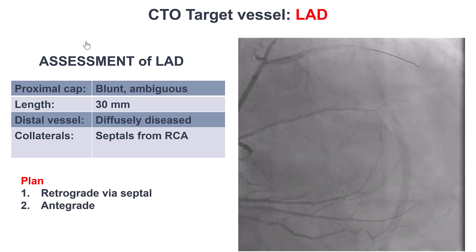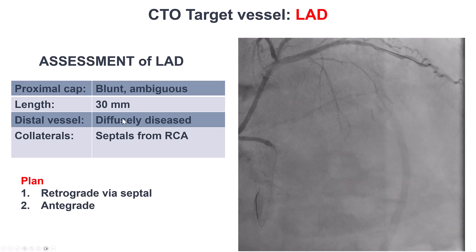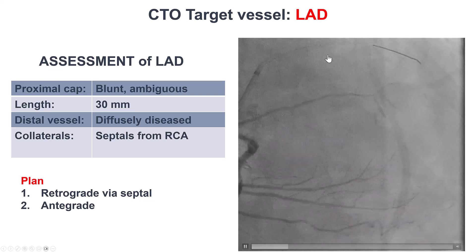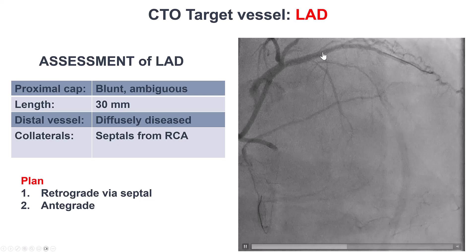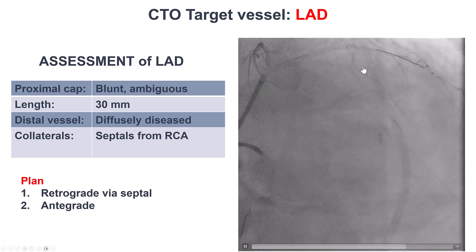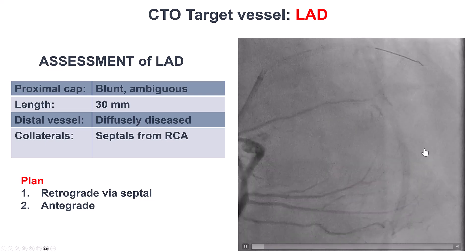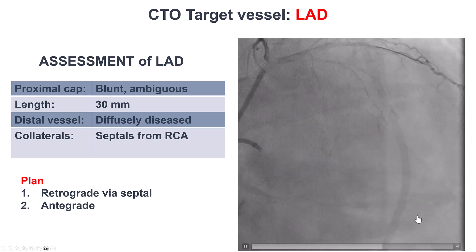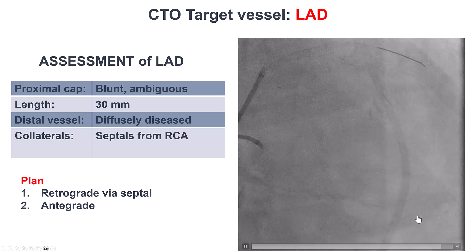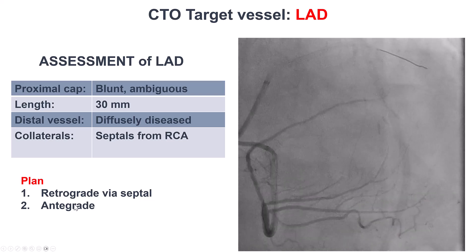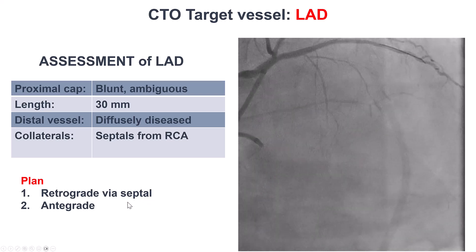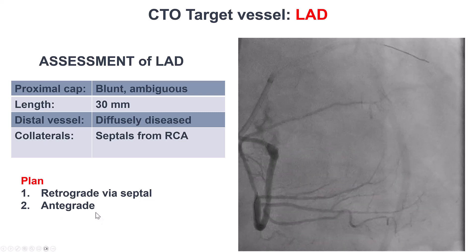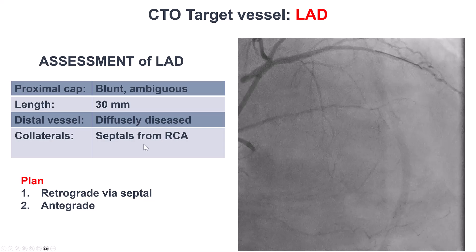So how to approach this? We have an LAD with a blunt, ambiguous proximal cap. The length seems to be about 30 mm, so fairly long. The distal vessel is diffusely diseased and fills mainly through septal collaterals from the right coronary artery. Our plan was to go retrograde to resolve the proximal cap ambiguity, and if that didn't work, potentially try antegradely to resolve the ambiguity.